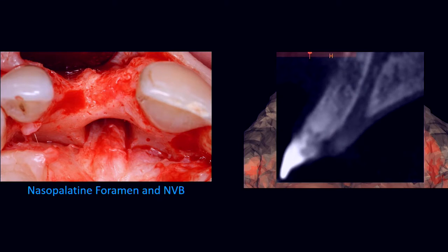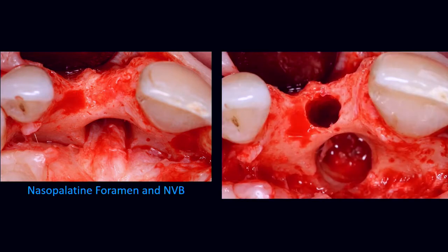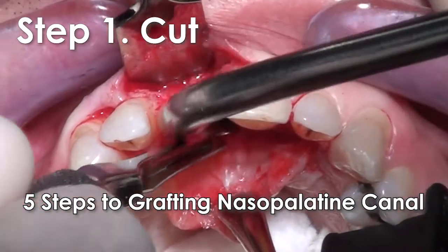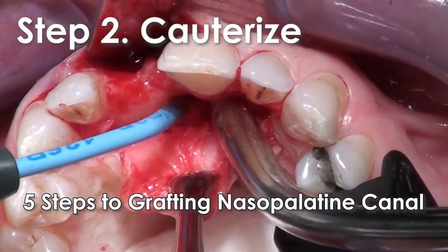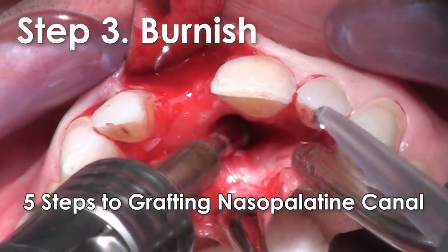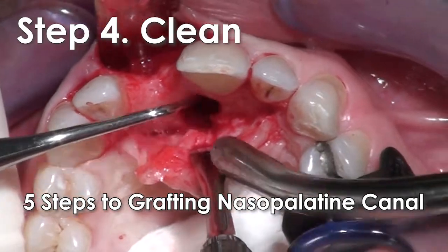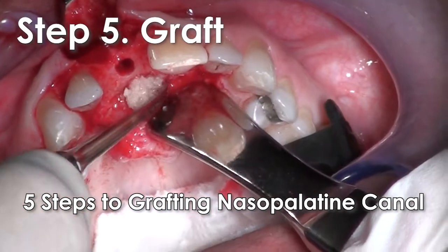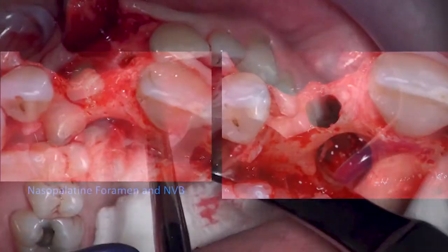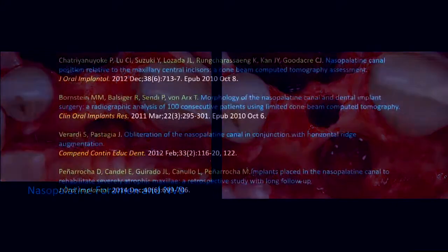You want to know the extent of it — does it go right up to the base, and is it continuous with the nasal floor? I need to know how deep it is. So I widen it, clean it out — I mean clean it out. I cut it for starters, I burn it with the ball cautery unit, go with an 8-round burr and then burnish everything to get nice good bleeders. Then I come in with my small curette and clean out all the residual tissue. I'm either grafting it — which I would in this case — or in my full arch cases, the implant will maybe go right in there. Just depends on the anatomy.